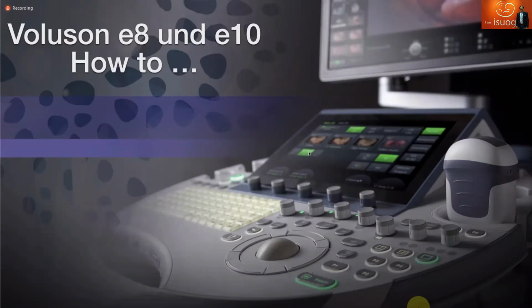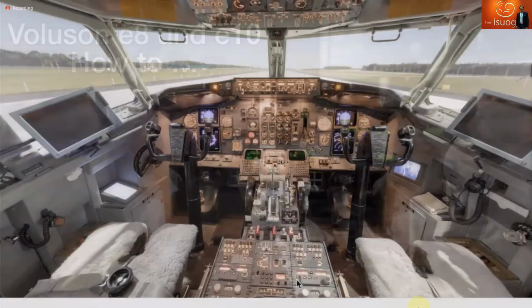I know even the subgroups of the buttons, because when I have a new machine, I look at the buttons, I ask the engineers what they have done new, and I try to change this or that button. And he once said, you know, it looks like a plane. Yeah, it looks like a cockpit. And this is why I put a cockpit as a comparison.